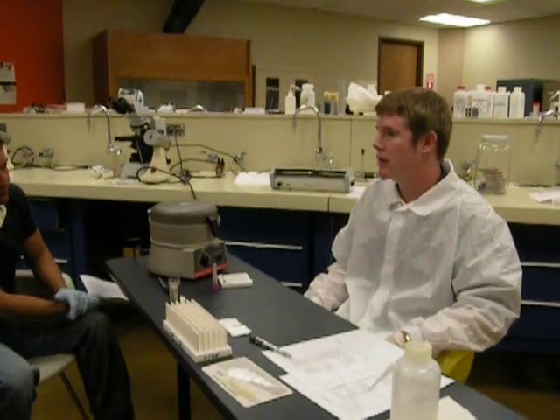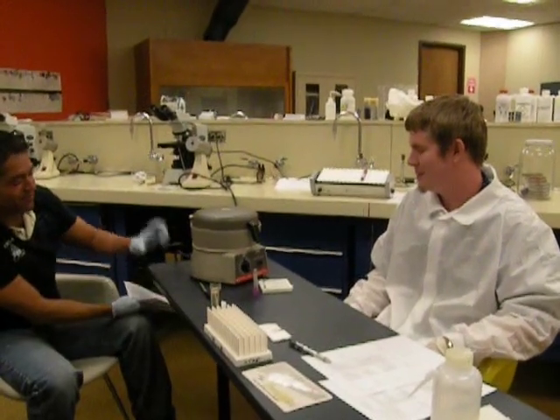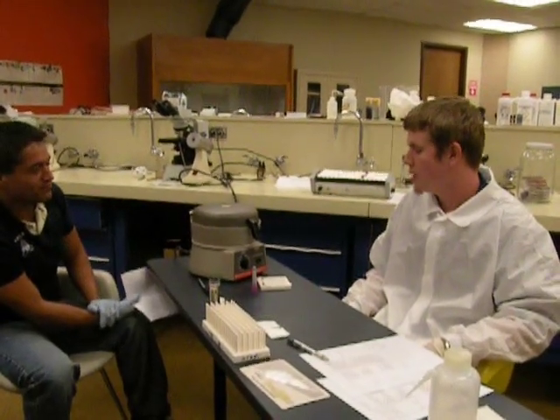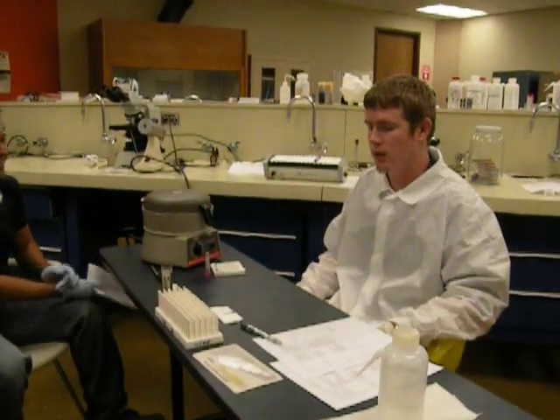Can anybody tell me what a Spun Hematocrit is used for? A Spun Hematocrit is a percentile volume of blood in a little test tube, which is a direct reflection of how much red blood cells are in your body. Let's get started with the equipment needed to perform the Spun Hematocrit.